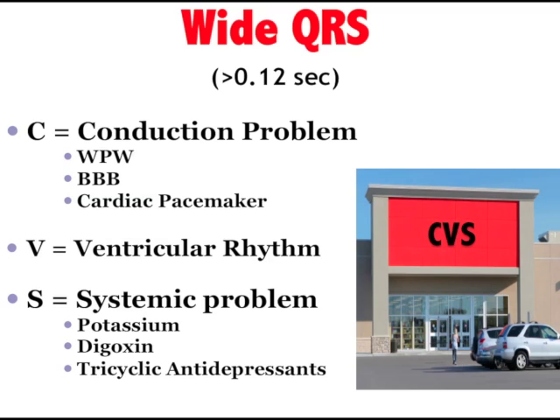What really got my attention, though, was that he received 2 negative chronotropes and it did not help. 2 different classes of negative chronotrope. When he got the digoxin, so he got a third, what I call a funnel drug. Funnel drugs are beta blockers, calcium channel blockers, and digoxin. They slow down conduction at the AV node, but when he got that third funnel drug, he went into cardiac arrest. He went into a pulseless VTAC.